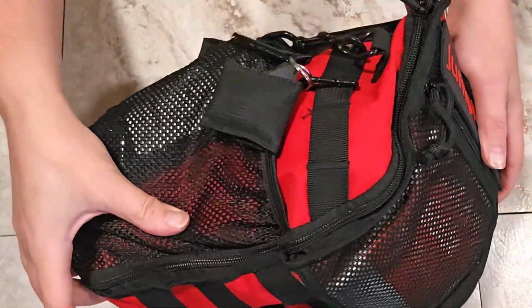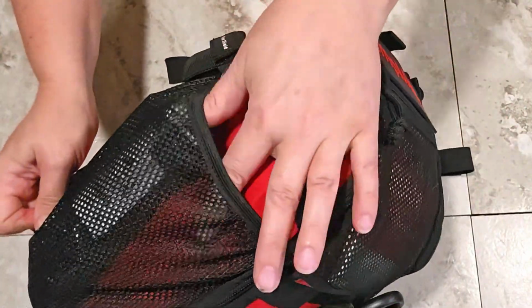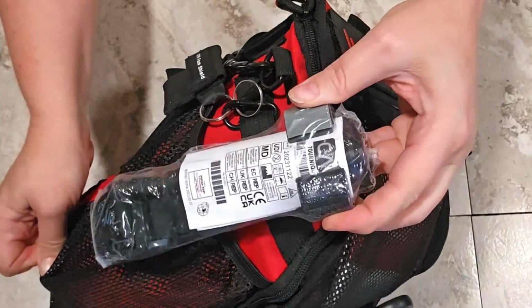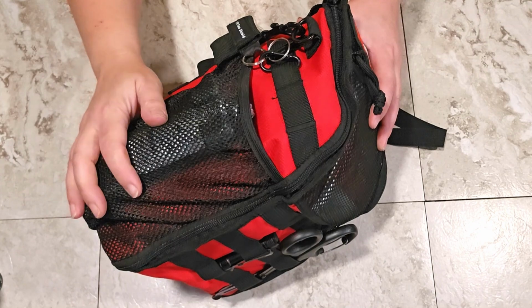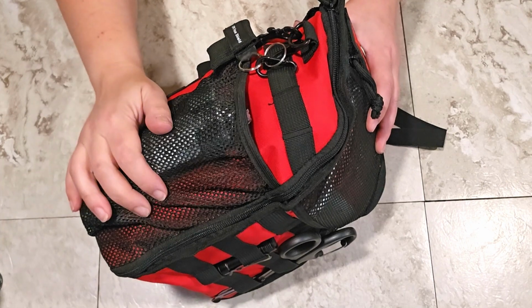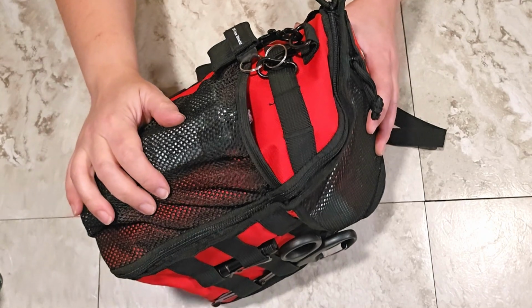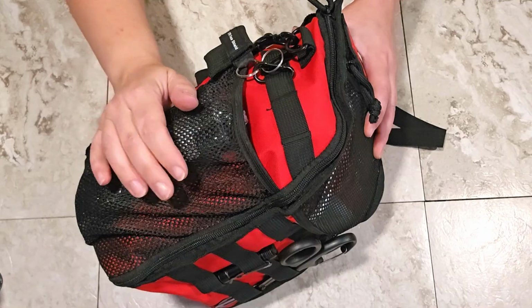And then right here on this first side pocket, one of the first things that you see, easy access, which is very important, is a tourniquet, a North American Rescue CAT tourniquet. This is extremely important. Of course, the order that you want to treat treatable traumas, the number one that you're going to want to treat is going to be a massive hemorrhage or bleeding, because you can bleed out and that can kill you faster than anything else. So a tourniquet is really important to have, and it's really important for it to be easy access right here.